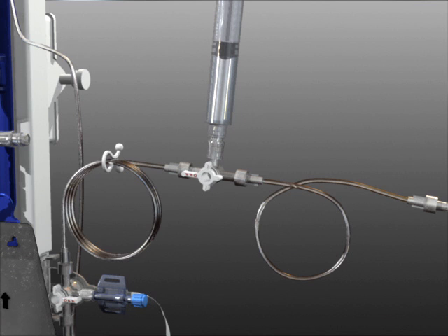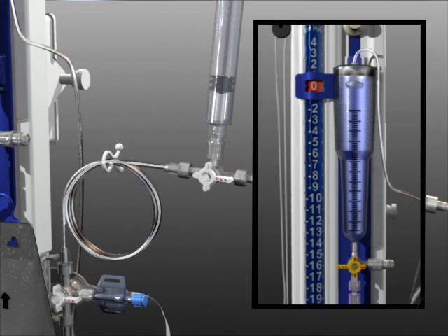Rotate the stopcock arm as shown to prime the short section of patient line tubing first. Rotate the stopcock 180 degrees to prime the patient line all the way through to the drip chamber. Use care to ensure all bubbles have been removed from the line.